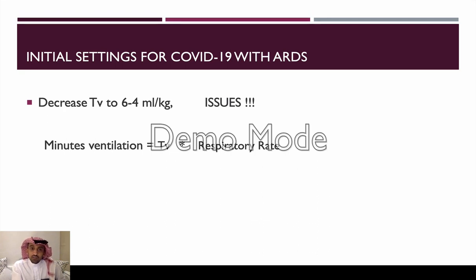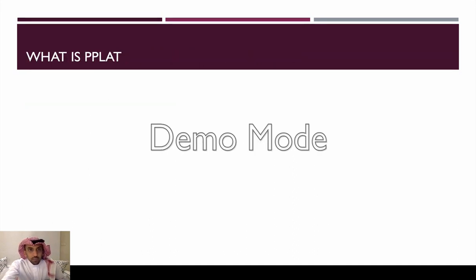Again, you have non-ventilatory measures and ventilatory measures. And the ventilatory measure, what I will focus on, is that you can increase the respiratory rate to overcome this issue. Non-ventilatory measures, you will have a separate talk about ARDS, and this can include sedatives, paralytic agents, and so on.